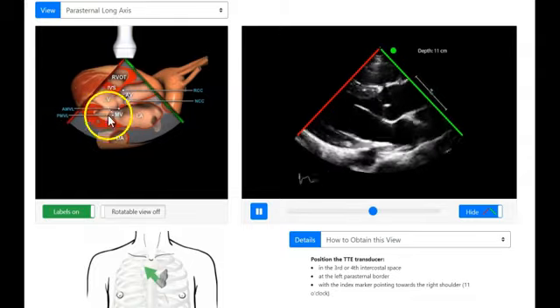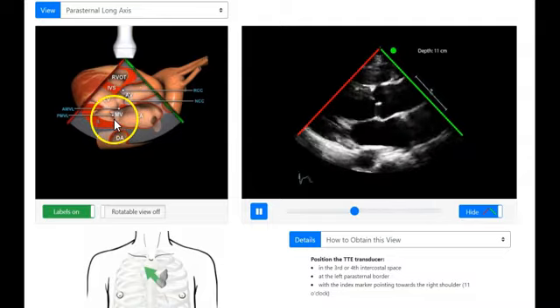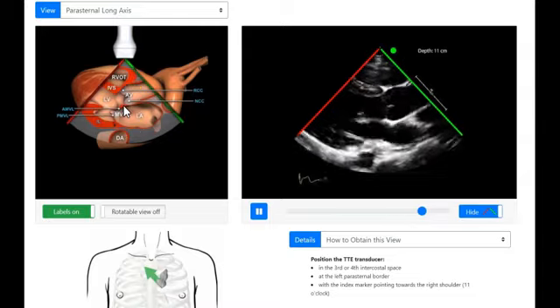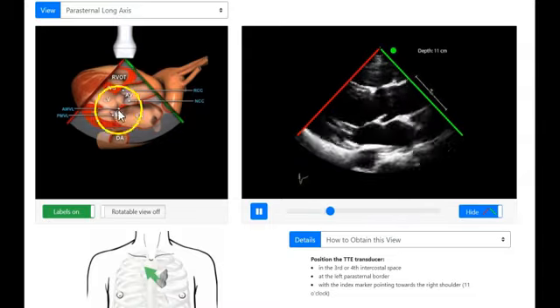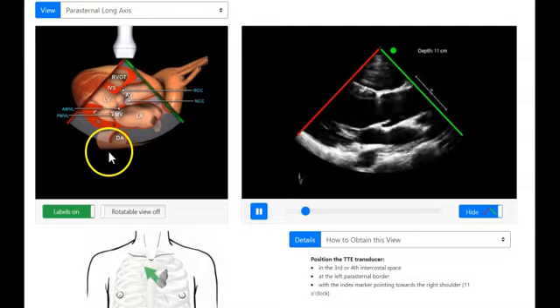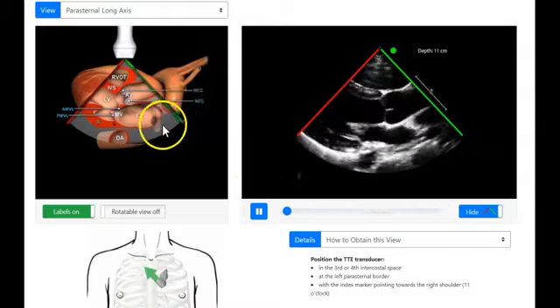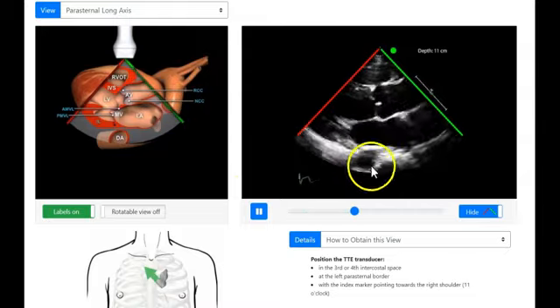And you can actually break it down into the cusps, if you want, of the mitral valve, where you see A1, A2 here, and A1, P1 here, and you can slide through and see different ones, P2, A2, and A2, P2, and so on and so forth. This is the descending thoracic aorta. You can see this coming down, how we're slicing through that, and this is where it is right here.